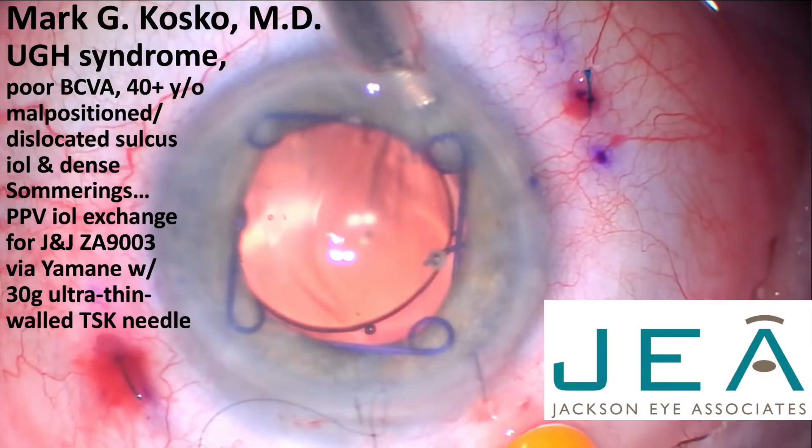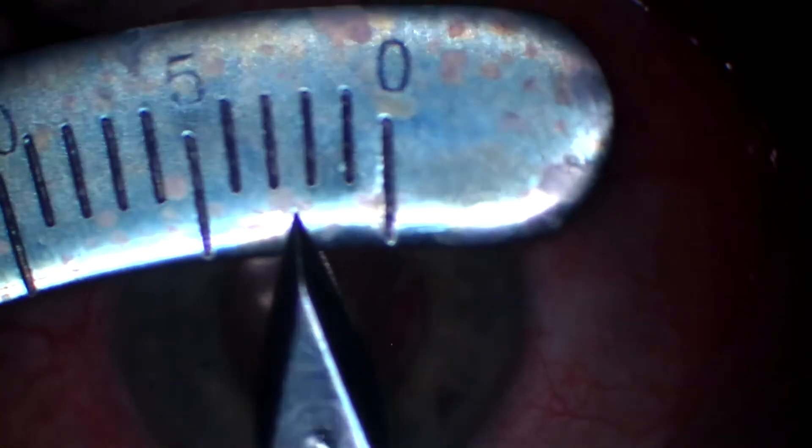Hi, this is Dr. Mark Cosco in Jackson, Mississippi. I'd like to share an interesting case of UGH syndrome — uveitis, glaucoma, hyphema syndrome — where a patient had had an eye well (IOL) in the eye for what she said was 40 plus years, and it was dislocated and malpositioned, giving her lots of issues.